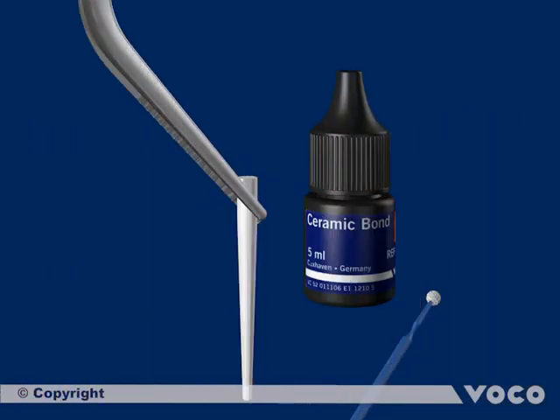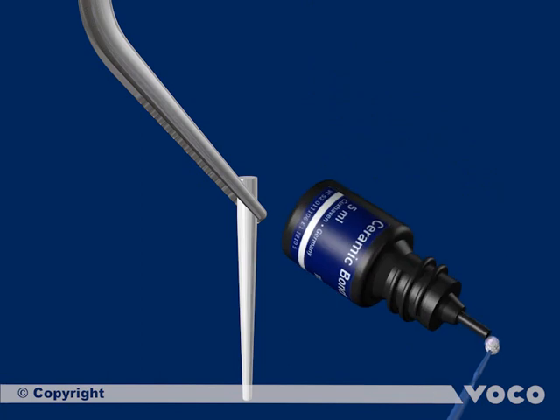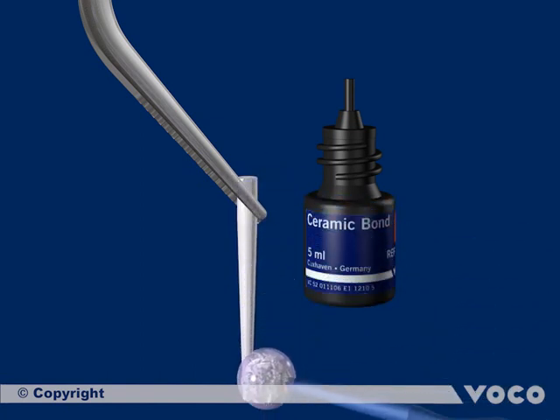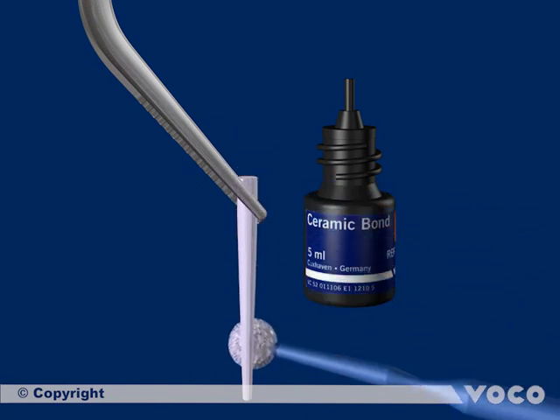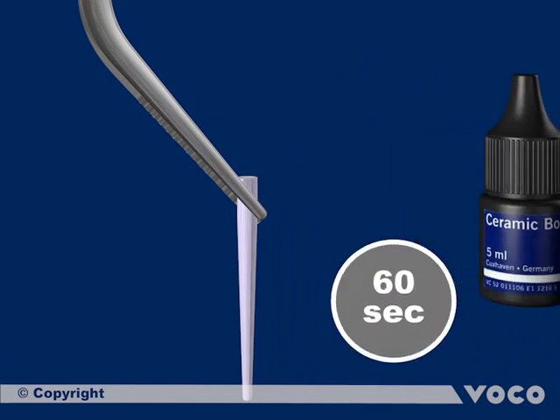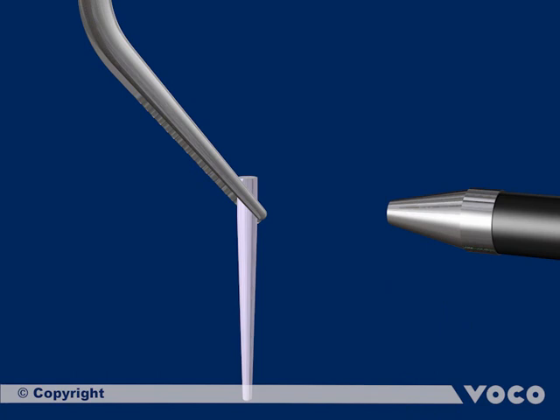The length of the root post is adjusted to the root canal, and after disinfecting the root post with alcohol, it is coated with ceramic bond. The silane coupling agent has to operate on the surface for 60 seconds. After that, solvents are removed by drying the surface with air.